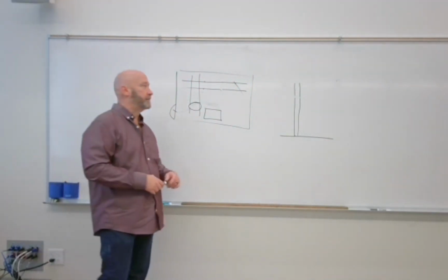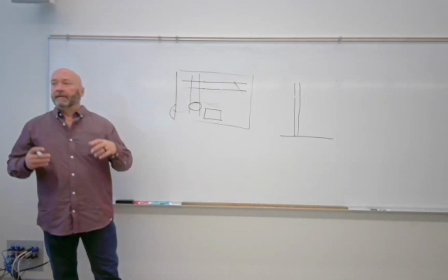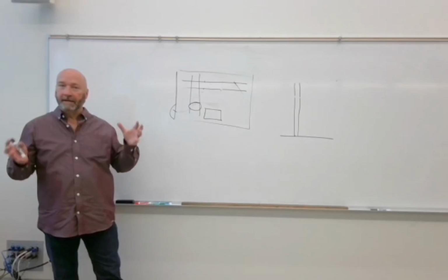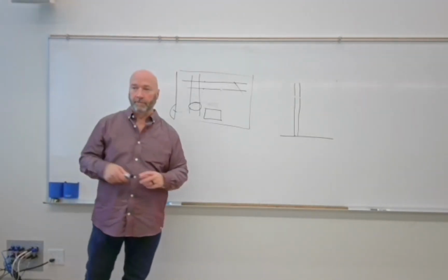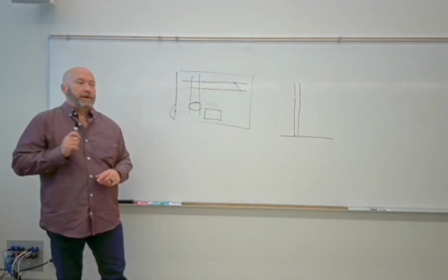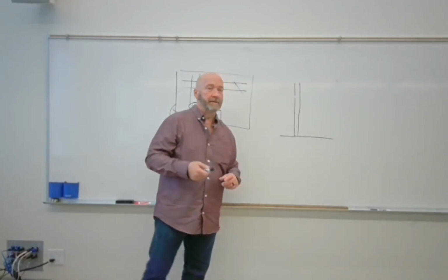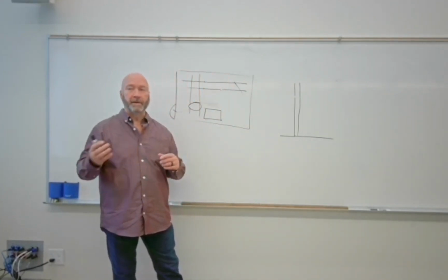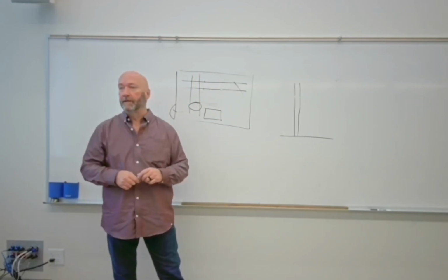And the other system is kind of a ceiling mounted system, but the X-ray tube and the image receptor are in one contained unit, and that's what we refer to as a C-arm or even a U-arm setup. We're in the process of adding another clinical site that should go active for the spring semester, and that is Azalea Orthopedic, and you'll see something like that over there.